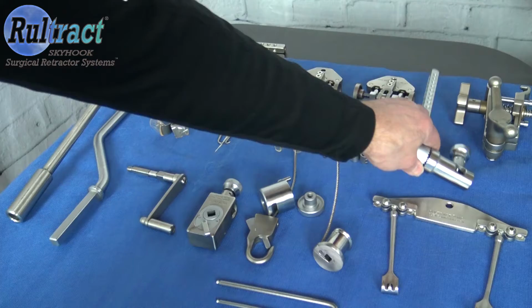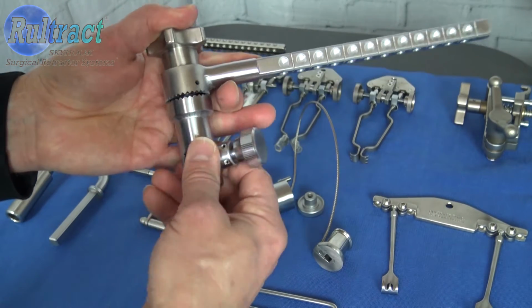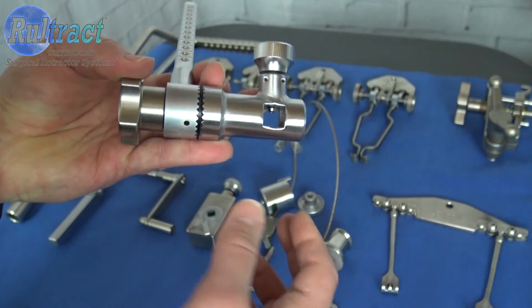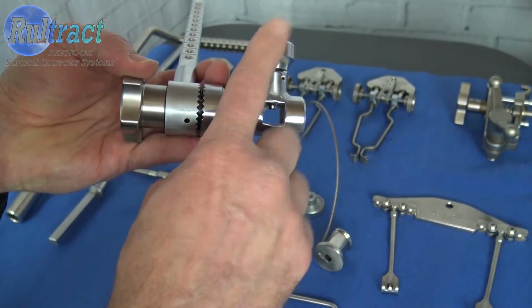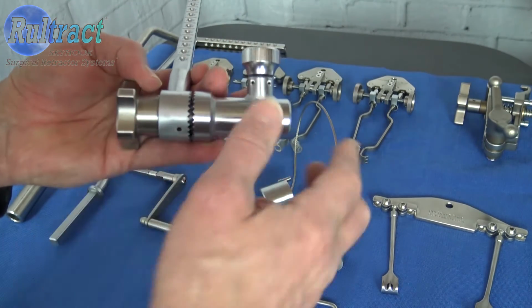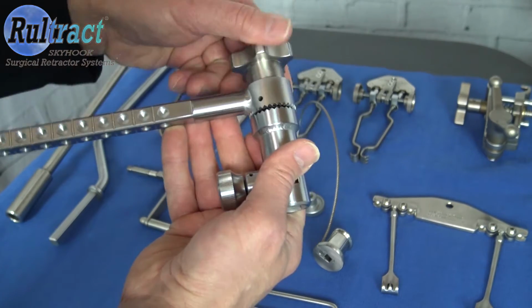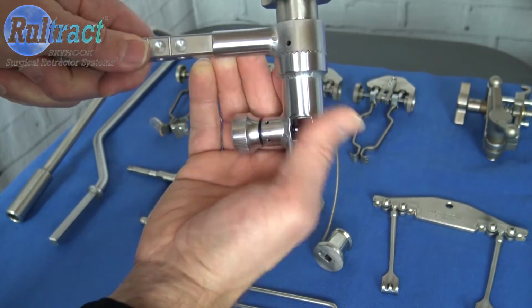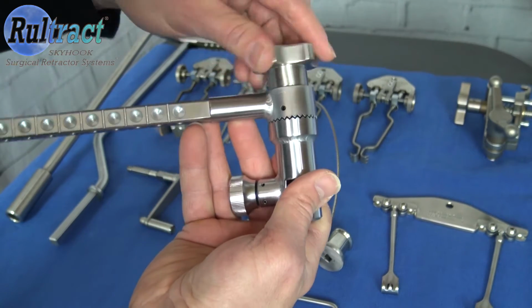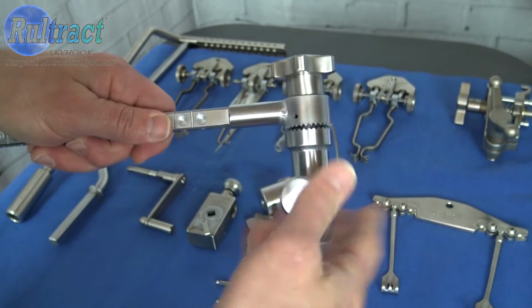So you're going to want to take your rotating extender bar prior to putting it through the cleaning cycle. Make sure that this lock knob is not opened or closed all the way. You want it somewhere right in the middle. And note once again that these knobs are not supposed to be removed, so do not remove these knobs. Next, prior to putting it through for the cleaning cycle, make sure that there's some separation between these teeth. We don't want it to be locked into position for cleaning or sterilization. So go ahead and have that somewhere right in the middle so that it freely rotates.